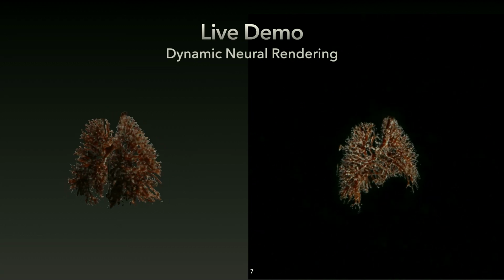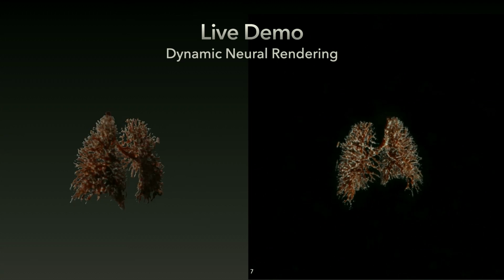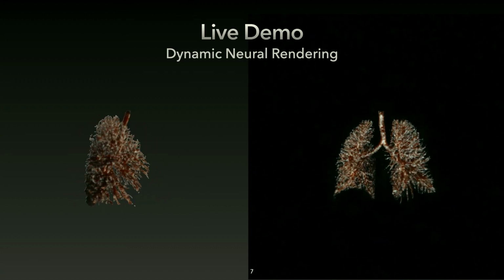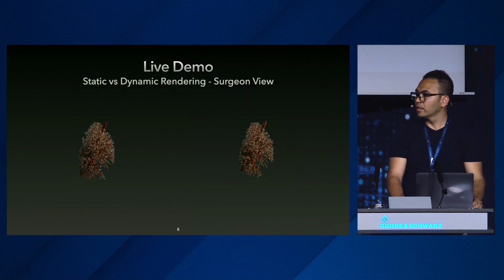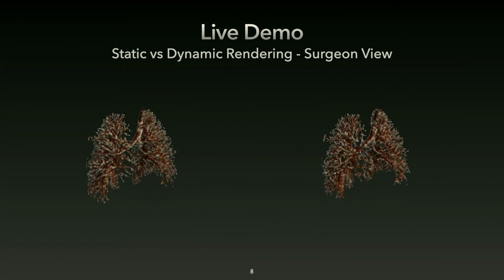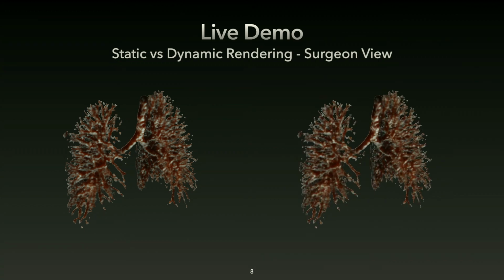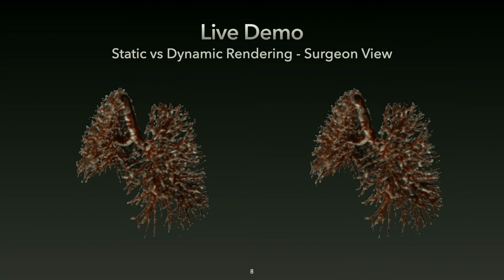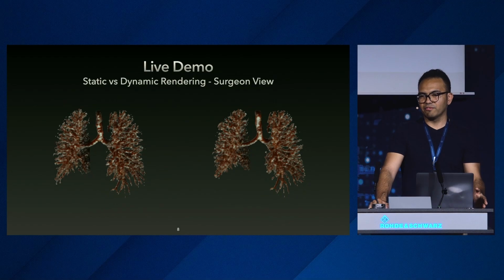Now let's imagine, so this is offline, right? Imagine the doctor, the surgeon, is with his mouse just scrolling and rotating and so on. And then it goes well, but then we activate real time because we want to be able to let it work in the operating room. And these are views of, again, the static model and the dynamic one. It might be possible for the surgeon to analyze something online, but in principle, I want to motivate the view that I foresee for this.